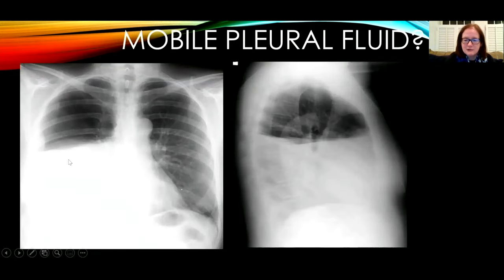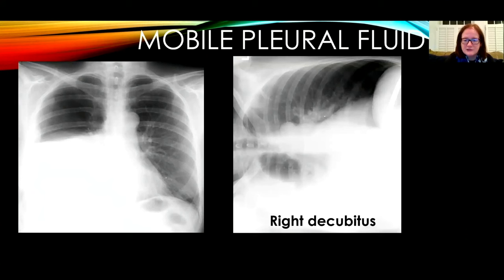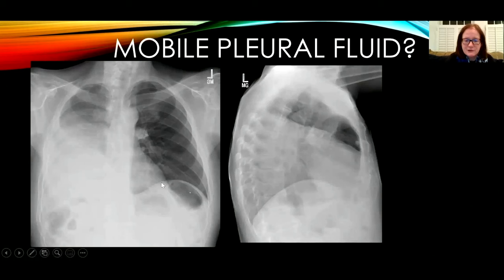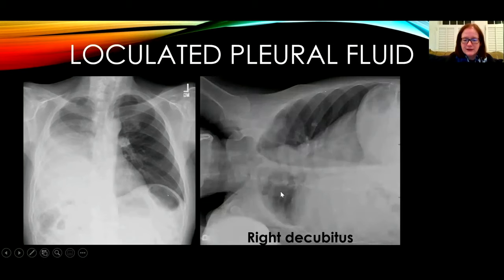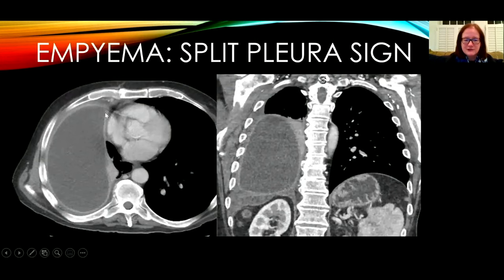This patient has a large right pleural effusion on frontal and lateral views, and on the lateral decubitus view with the right side down, there is free layering indicating it's not loculated. Another patient with a large right pleural effusion shows no change in configuration on decubitus positioning, indicating it is loculated or localized and prevented from moving freely. This patient has thickened visceral and parietal pleura — the split pleural sign in empyema.